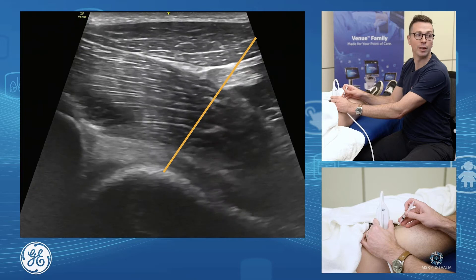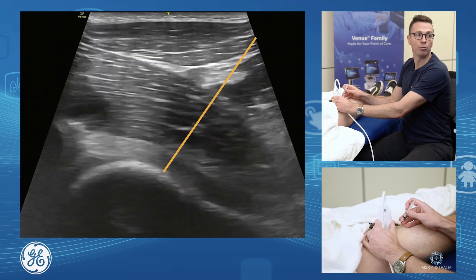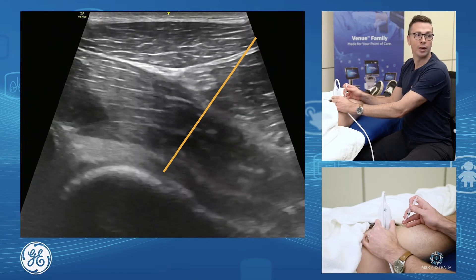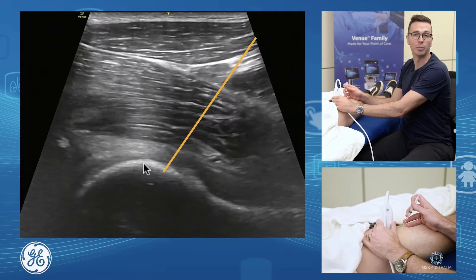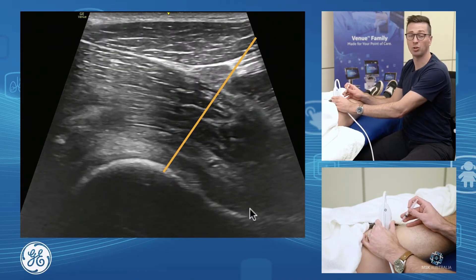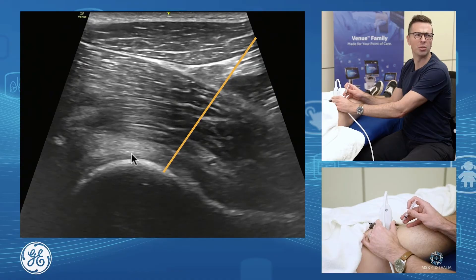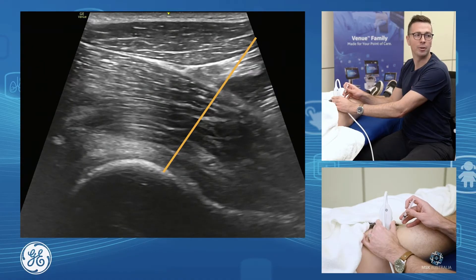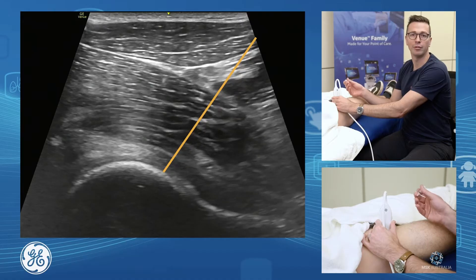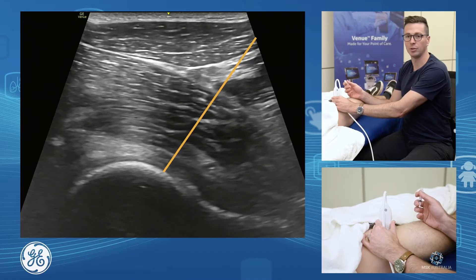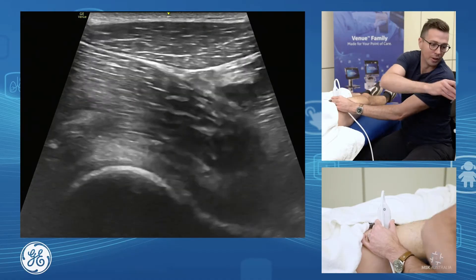We drop down and hit on that head-neck junction. But really, as long as you get anywhere underneath the iliofemoral ligament, as long as you're anywhere underneath that joint capsule, you're within the joint. You can go anywhere along here, pop your needle down, and as it injects, you'll see it fill up the space — you'll see that capsule lift off. So drop down in through there.